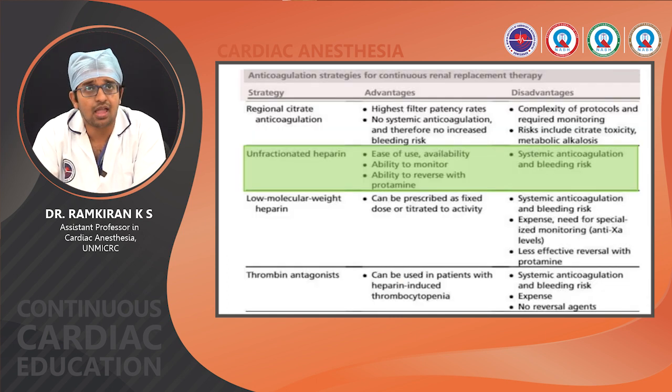Okay. So as we know, CRRT requires some sort of anticoagulation. So it can be regional citrate anticoagulation, which is most commonly used, and if there is any contraindication to that, then you use some unfractionated heparin.